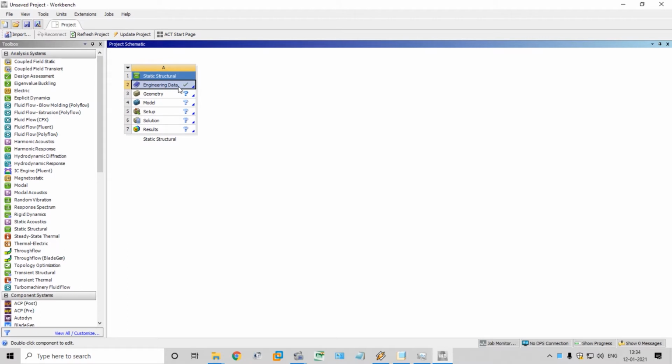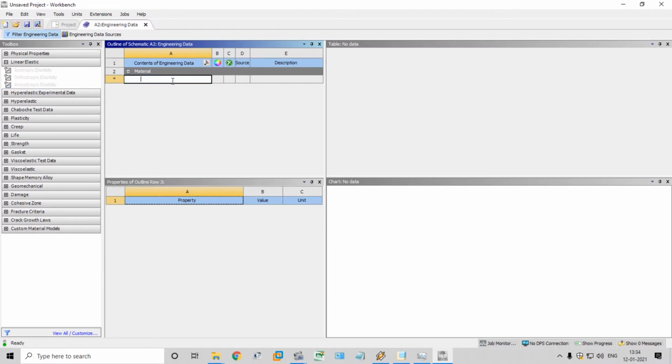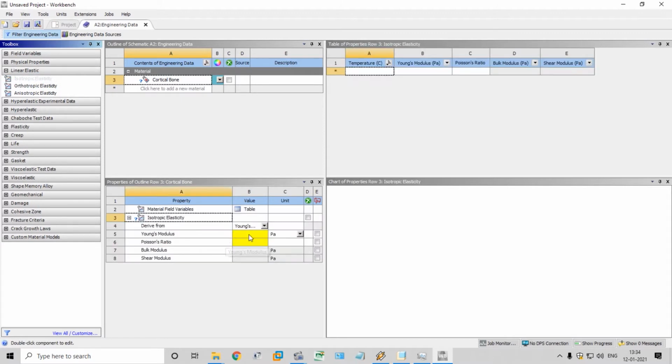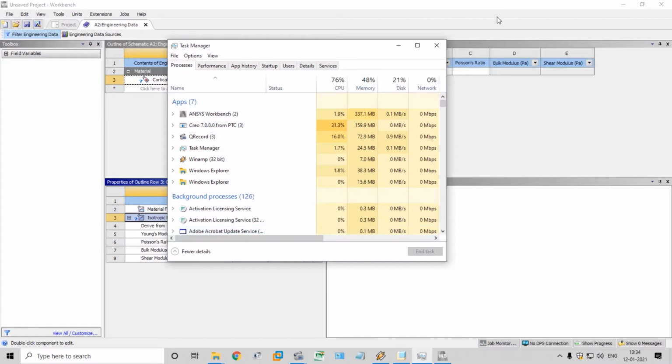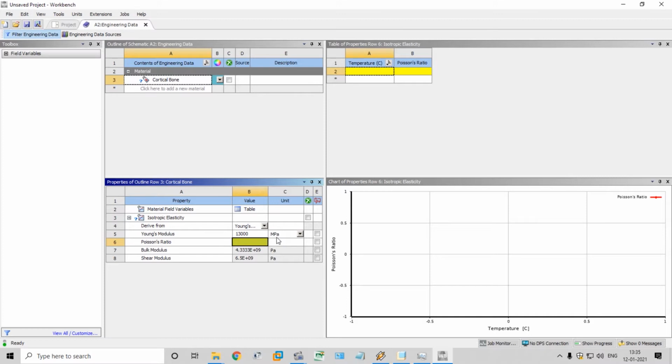Okay, now we are firstly going to insert the engineering data, which means the different materials have different data, elasticity. In this project we are going to use three materials: cortical bone. In that cortical bone, isotropic elasticity, Young's modulus in megapascal. Young's modulus 13,000 megapascal for cortical bone. 0.3 will be the Poisson's ratio.